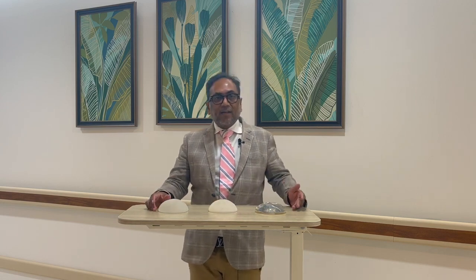But later research showed that the texturing can also cause some problems like rare breast cancers arising from the capsule. So then the implant companies started reducing the texture, which is coarse texture like this, and then it became very fine texture. And of course, these days we're using no texturing implants. It's the smooth implants like this. There's no texturing at all, for the simple reason that the chances of developing the anaplastic lymphoma, which arises from the capsule, is very, very less with the smooth implants.